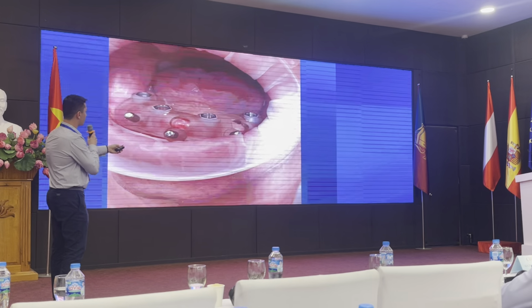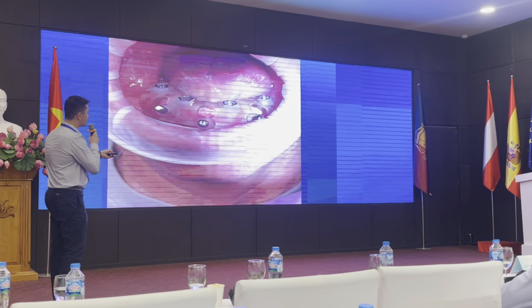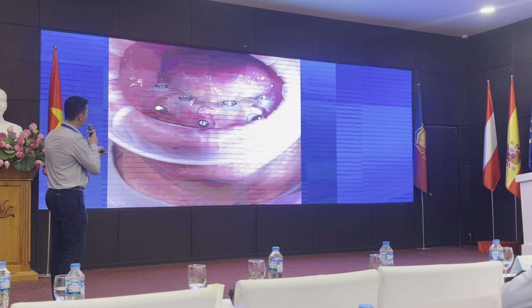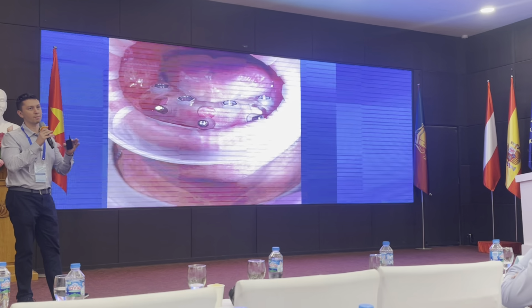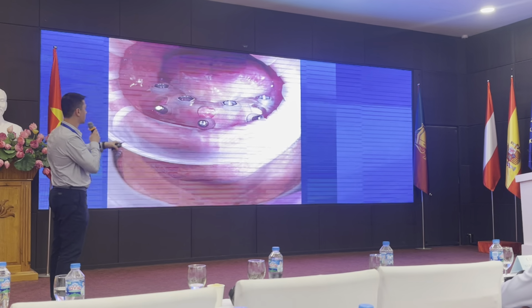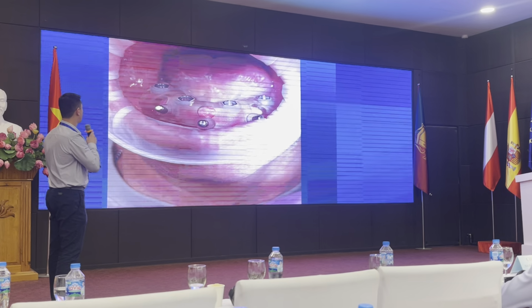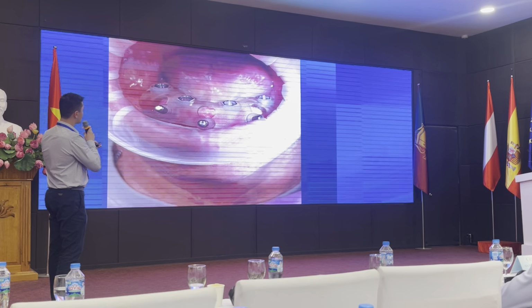But we're turning this soft tissue guide into an anchor pin guide. So we can see white, the soft tissue is blanching. So we know that there's good pressure on top of the surgical guide against the soft tissue of the gum tissue. So at this point, now we can start using our tissue punch.